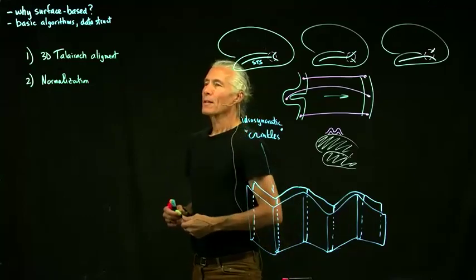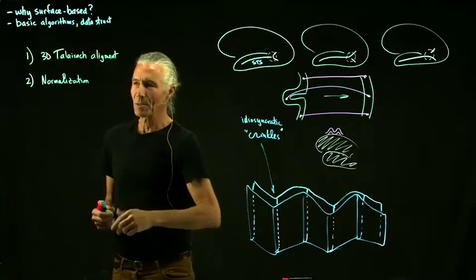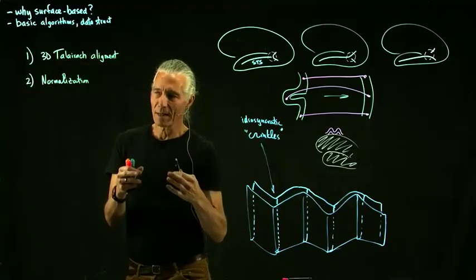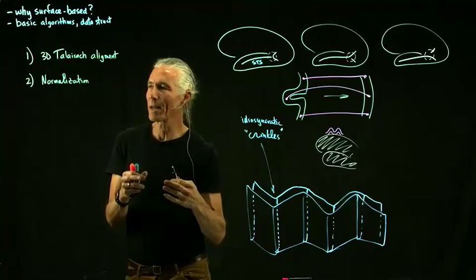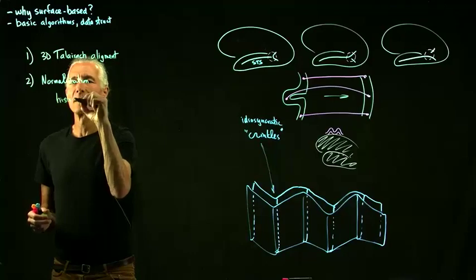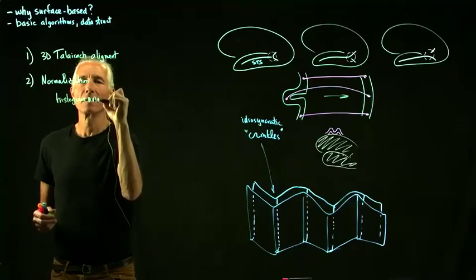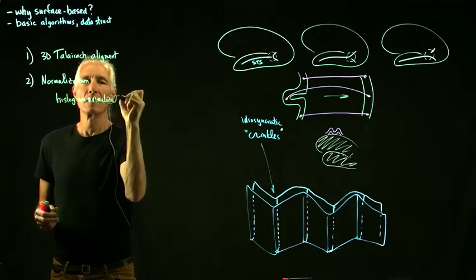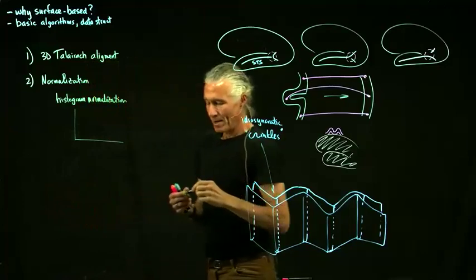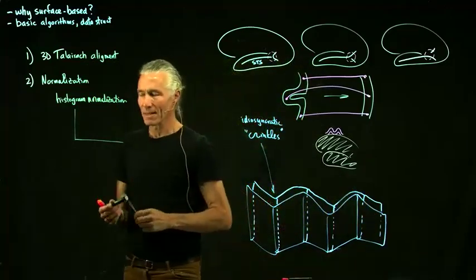So that can be a problem. There are all different kinds of ways of trying to do normalization. We could try to collect a quantitative scan, but most people don't do that. One example is something called histogram normalization. We do a histogram of the brightnesses in a little chunk of the brain.